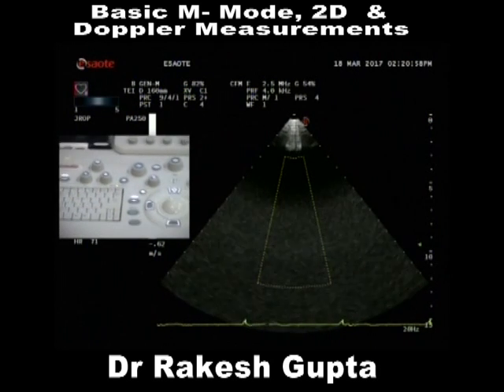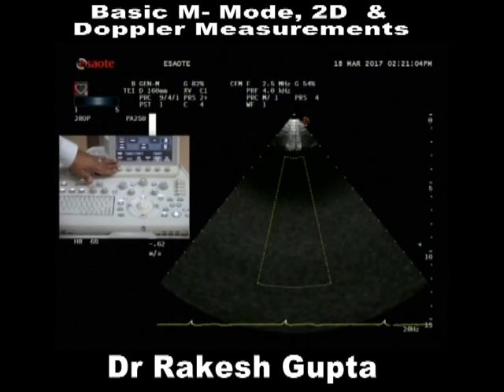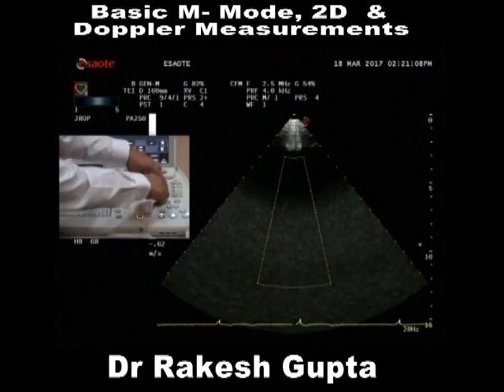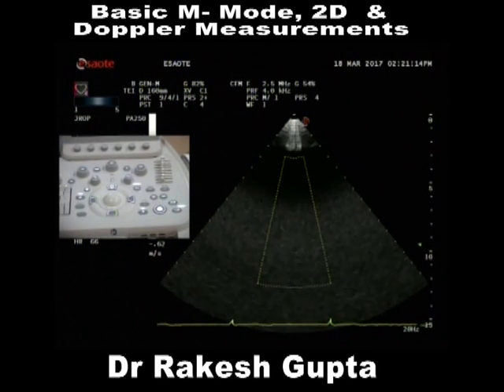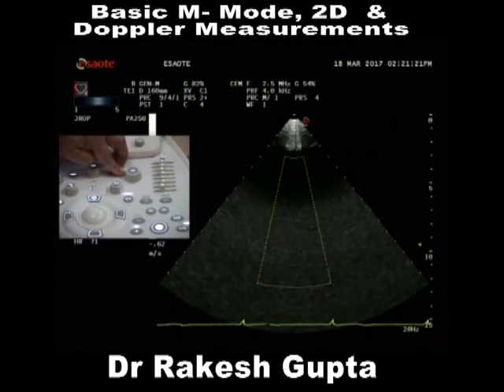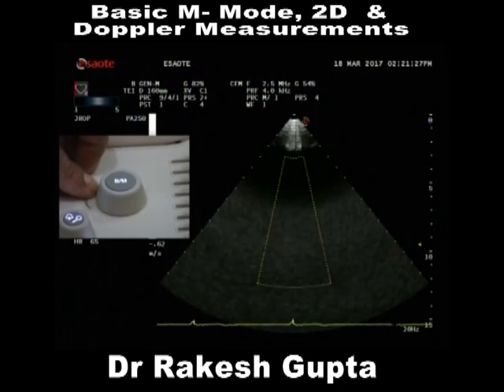Right, now that's great, perfect. Now look, there is a jumble of knobs. What are these knobs? Now let's focus on this part, or the bigger one. This is BM. Focus now. Great, zoom in. Good. This is BM: B mode and M mode.